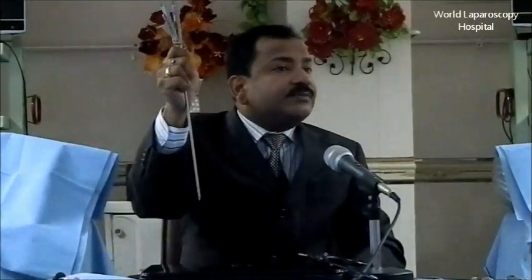If the elevation angle is 90 degrees, can you make an omelette? You cannot make it. How can you turn it? If you try to move it, you will burn yourself. It will jump onto your body with the elevation angle of 90 degrees. But if it is 30 degrees, you can turn it, this side, that side. Elevation angle also depends upon your baseball diamond concept of port position.